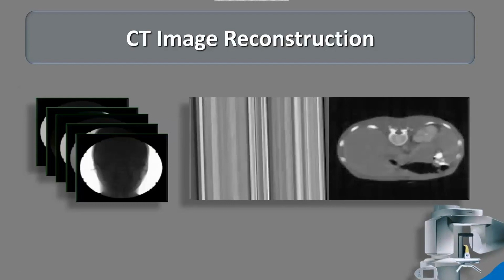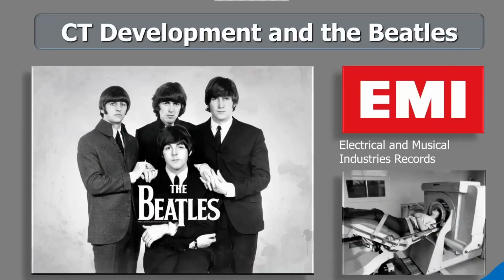And that's the same thing with a cone-beam CT. So the machine you have in 5 years from now would actually be better than the one you purchased today, all based on the software. So that is very nice to know, especially in our world where everything becomes obsolete so quickly. Now, trivia question. What does the Beatles have to do with CT? Well, they actually funded medical CT.